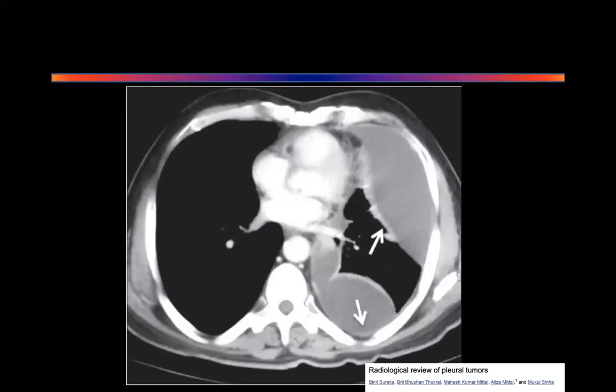So this is a CT scan of chest, contrast enhanced, in a mediastinal window. We are looking at multiple loculated cystic kind of fluid-filled lesions, which are seen around the circumference of the pleura, around the circumference of the left chest, and the surrounding pleura appears to be enhancing. The parietal pleura appears to be enhancing, and the lung is compressed because of the fluids. Could be multiloculated pleural effusions.